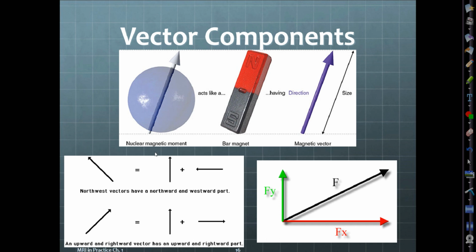Okay, so interchangeable. And it's also important to remember that if this vector is sitting in an oblique fashion, you can divide it up into smaller vectors at those right angles. This is a good diagram, where it has a long oblique vector.